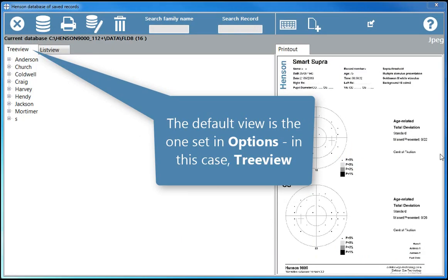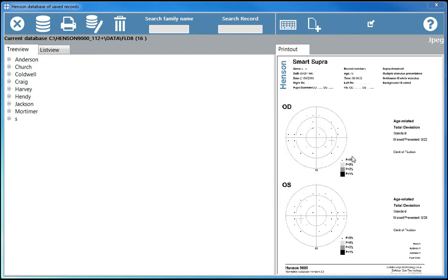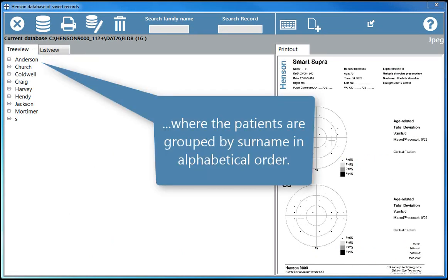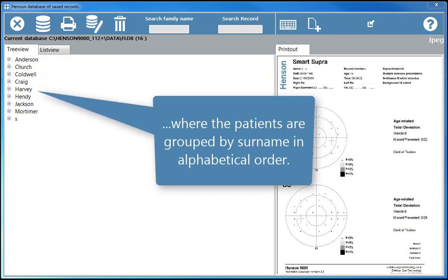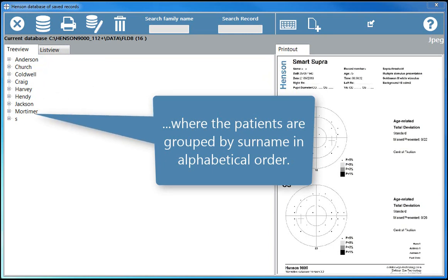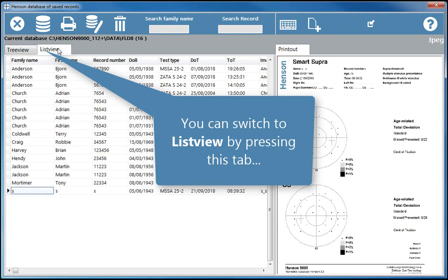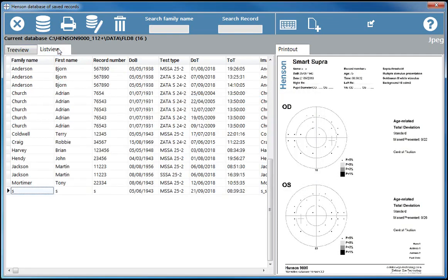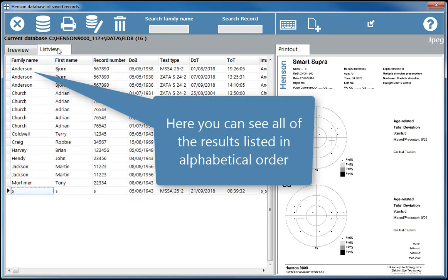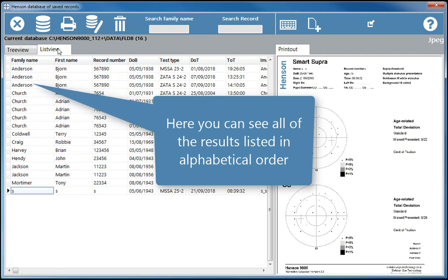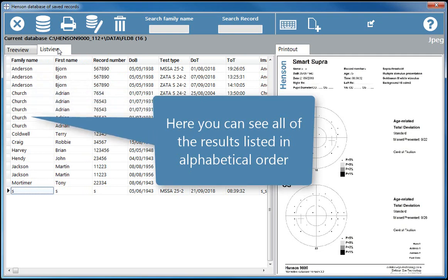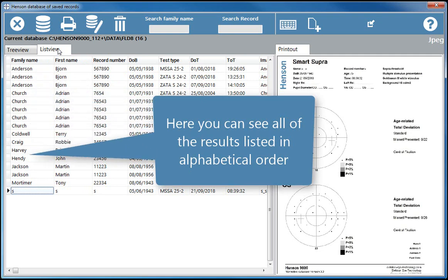The default view is the one set in options, in this case tree view, where the patients are grouped by surname in alphabetical order. You can switch to list view by pressing this tab. Here you can see all of the results listed in alphabetical order.